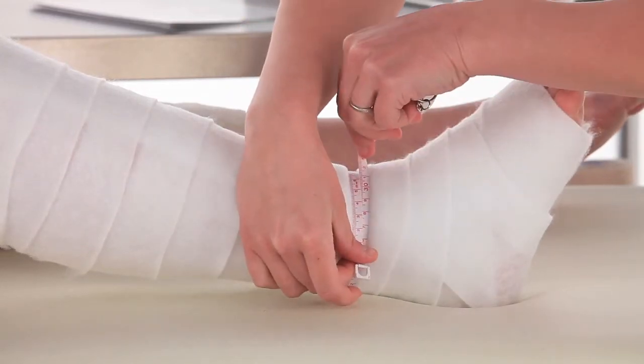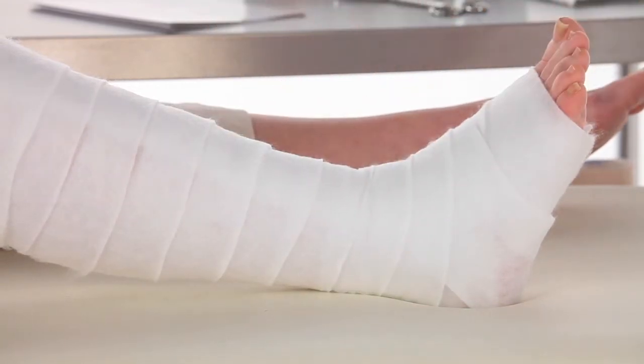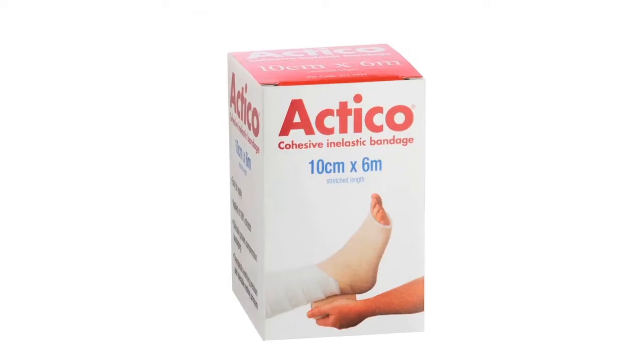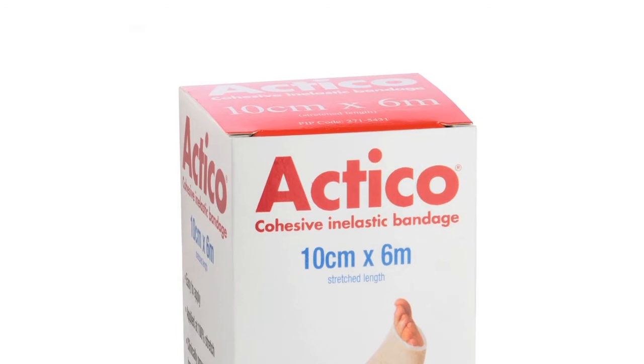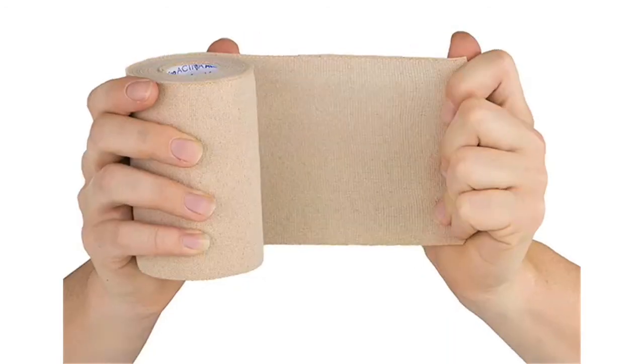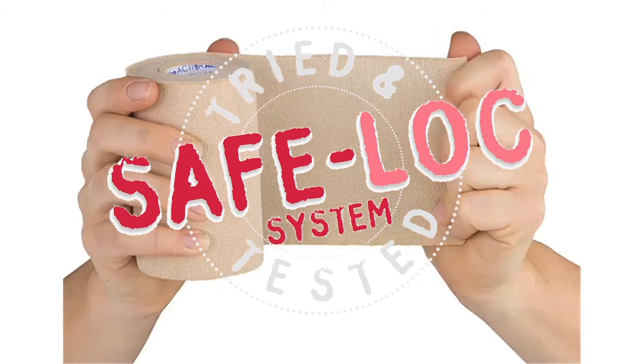Remeasure the ankle. If the ankle circumference is 18 to 25 centimetres after padding, please apply another layer of Actico. Actico has a built-in feature — the SafeLock system — which delivers a consistently safe, accurate and easy application using the lock and roll method.